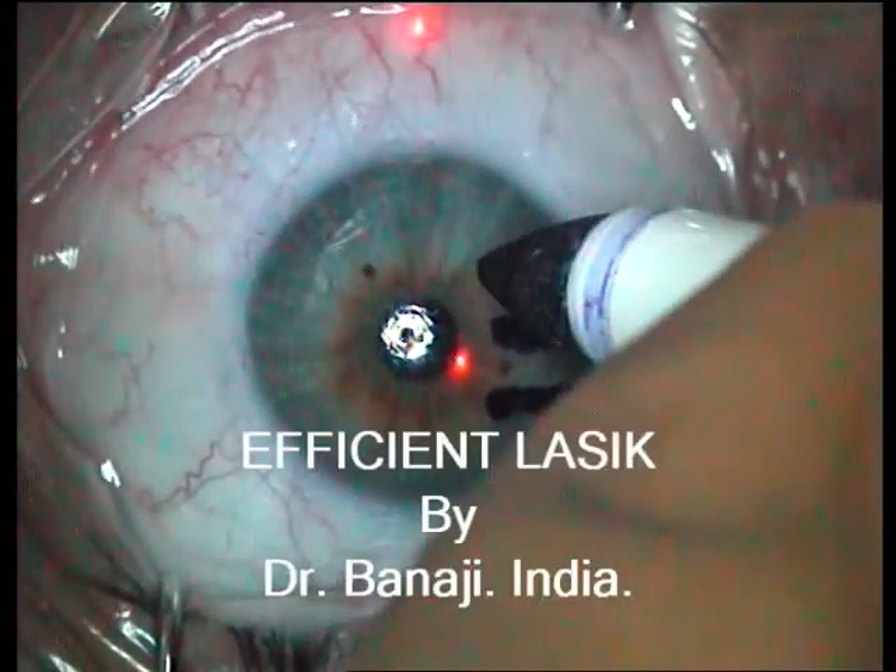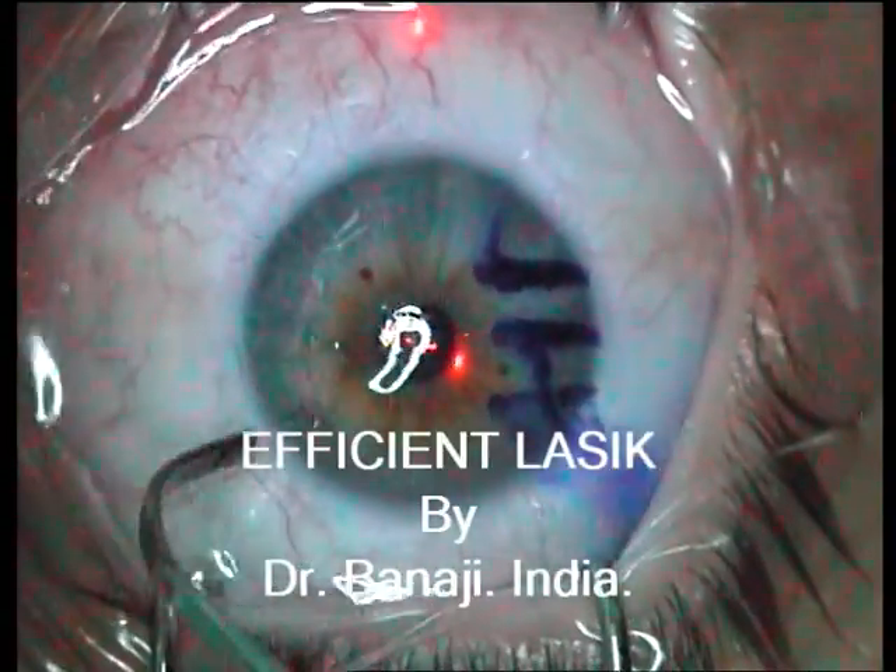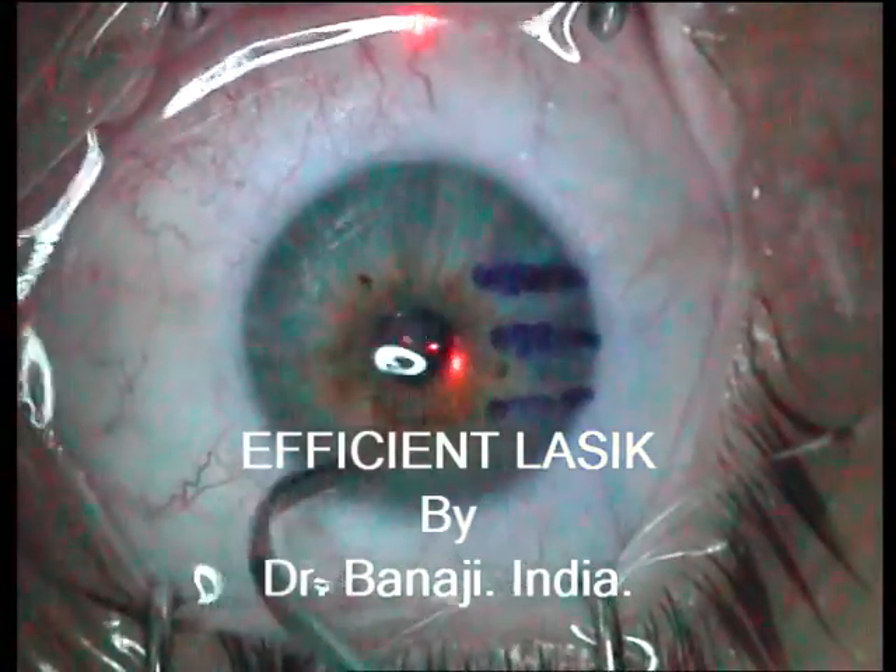In this series of videos, you will see three short LASIK movies on how I perform my LASIK.